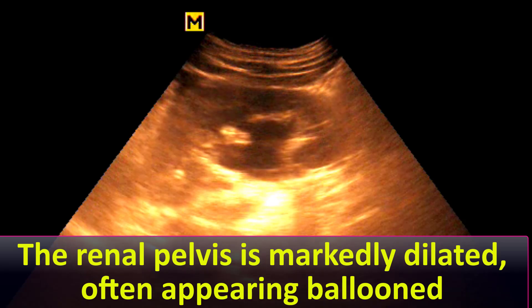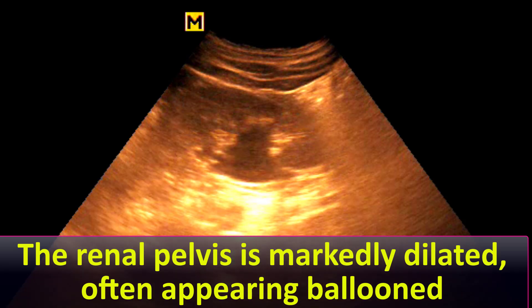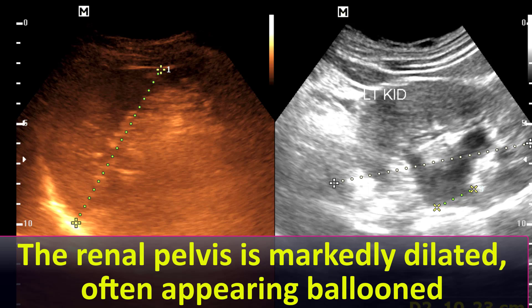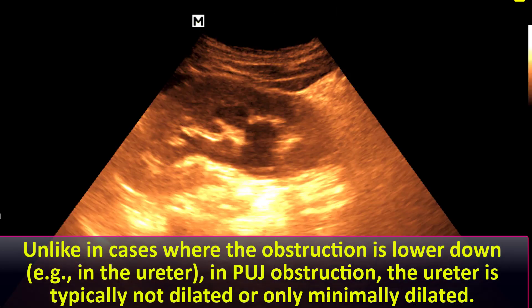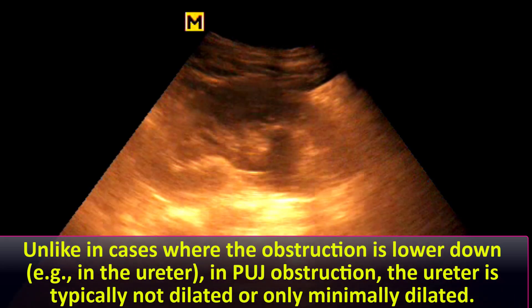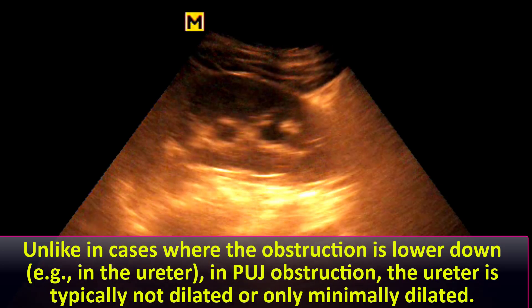Sonographic features of pelvicalyceal dilatation due to PUJ obstruction: The renal pelvis is markedly dilated, often appearing ballooned. The calyces are dilated, but less so than the pelvis. Unlike in cases where the obstruction is lower down, e.g. in the ureter, in PUJ obstruction the ureter is typically not dilated or only minimally dilated.